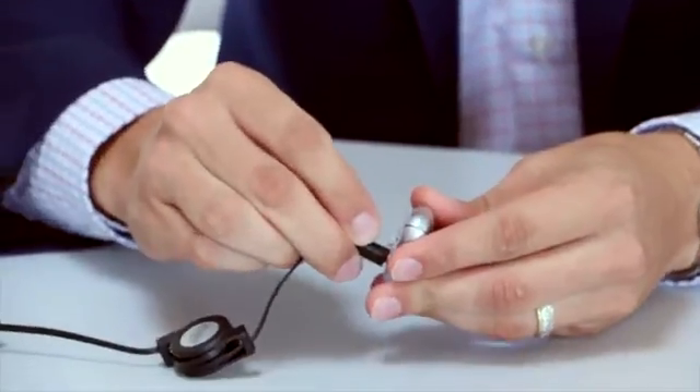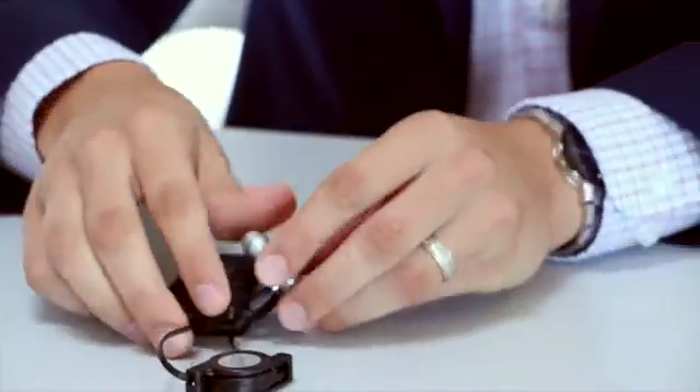It now also comes with a rechargeable battery. Simply connect. I'll now put the Cefali 2 on to show you another key advantage of the new device. Take the electrode and place it on the forehead just as you would with the Cefali 1. Take the device and simply connect.